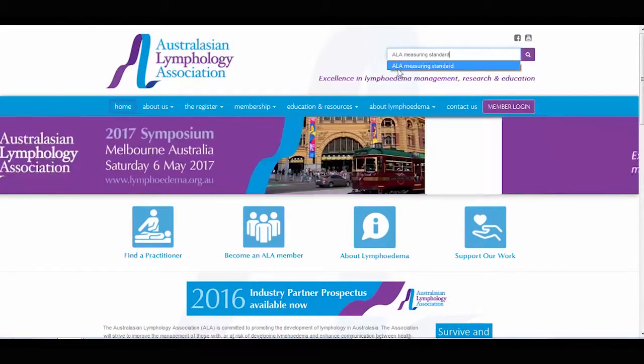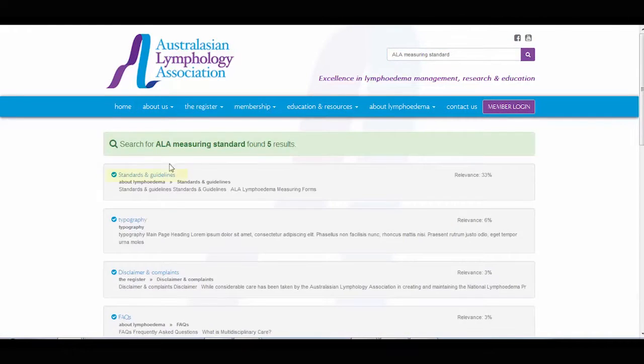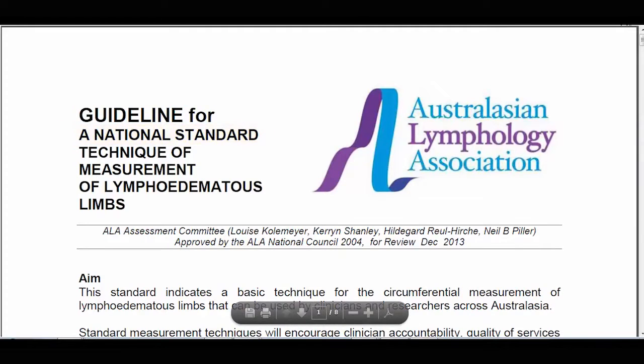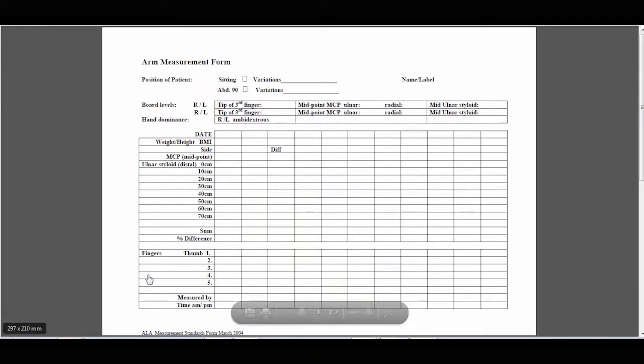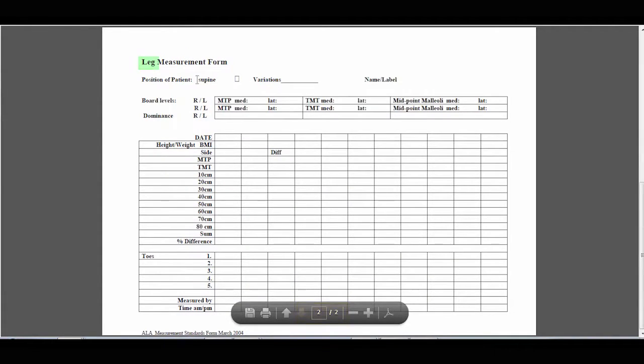The circumference measurement process follows the Australasian Lymphology Association measuring standards. These standards and the recording form used in this demonstration are contained within the Primary Health Network Care Pathway and can also be found on the Australasian Lymphology Association website.